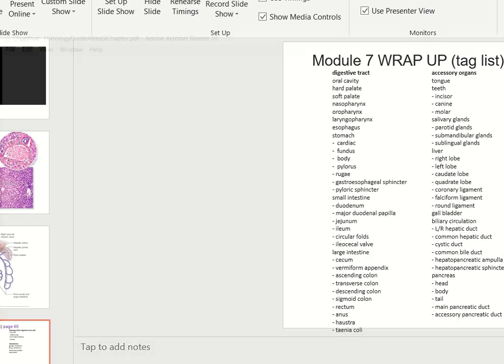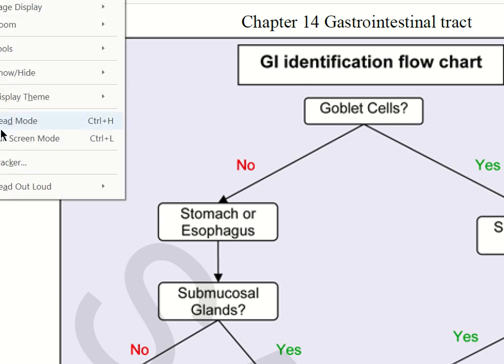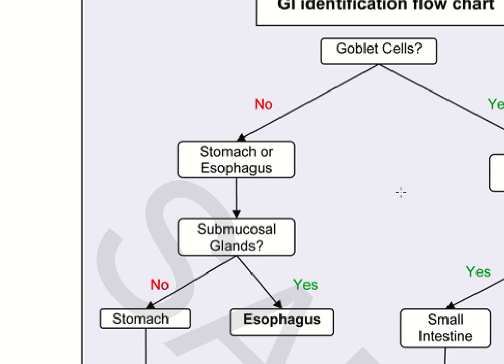Okay, so I think this is a wonderful little, let's see if I can go to the read mode.